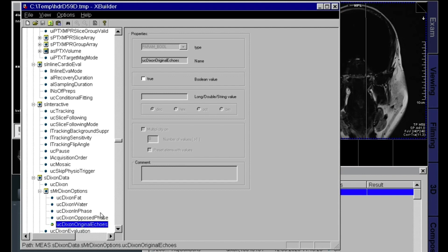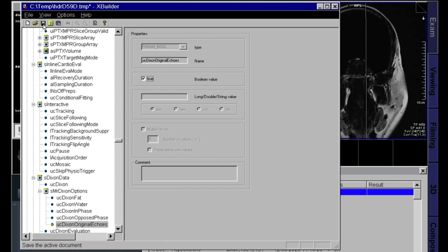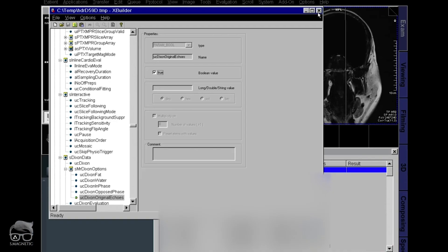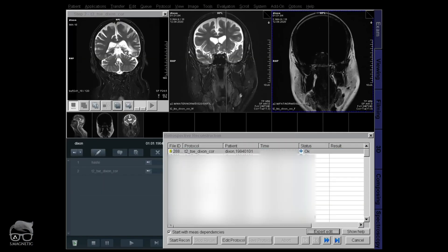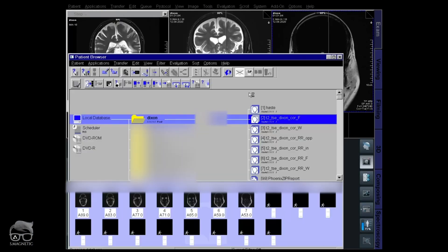So let's say we're going to have all four images. So we take that true. We save that one, we close it, and we start the recon.